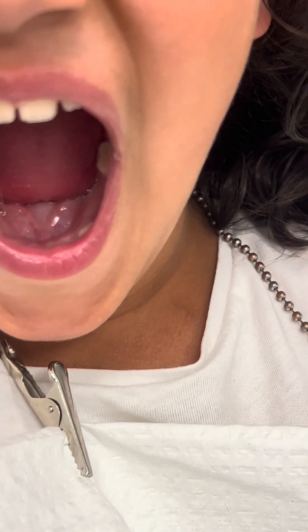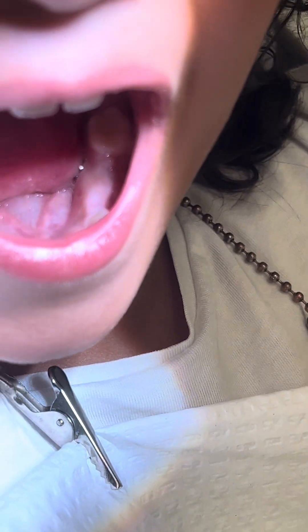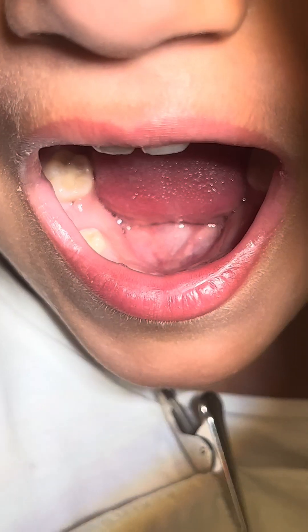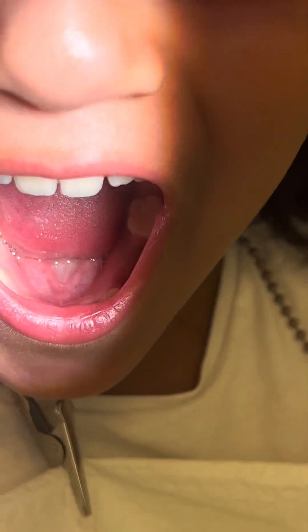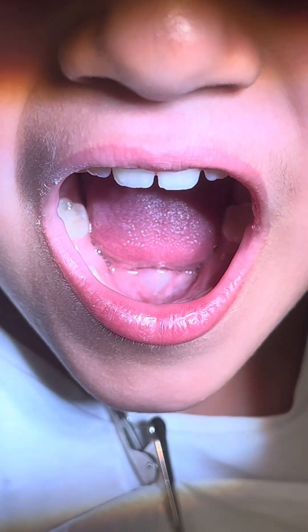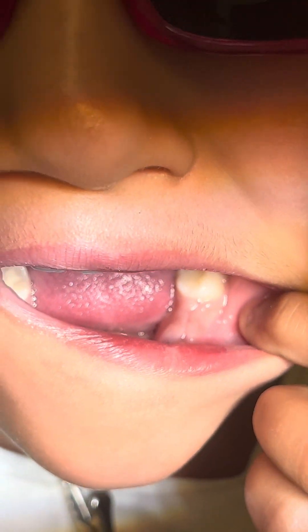What is a space maintainer appliance fabrication? When considering a space maintainer for a lost or soon-to-be extracted primary tooth, it is important to have a radiograph of the area to determine the location of the succedaneous tooth. If the tooth is about to erupt, then space maintenance is not warranted.